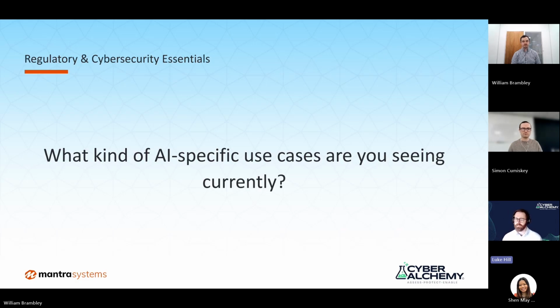And the cybersecurity issues with each one of those things, right? If you're going to have the AI on the device itself, depending on what the device is, then that brings in a whole host of different issues as well. If you've not considered the security of the device itself, as Simon was just discussing there, and I think that's becoming more and more common that people are seeing that, right? So on your hardware devices, like the diagnostic interfaces, like a JTAG or something like that, people are seeing the huge risk that they can pose and then taking appropriate measures. And we'll discuss how you identify what the correct measures are for your solution from a cybersecurity perspective a little bit later in the webinar, so hopefully give people some actionable stuff there as well.